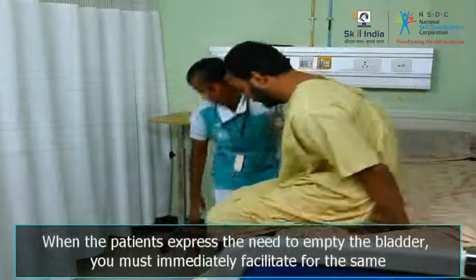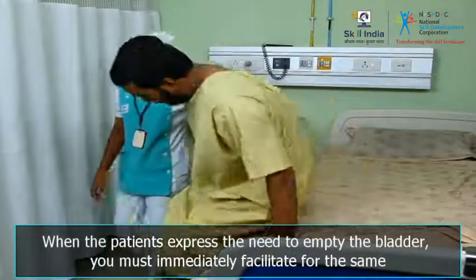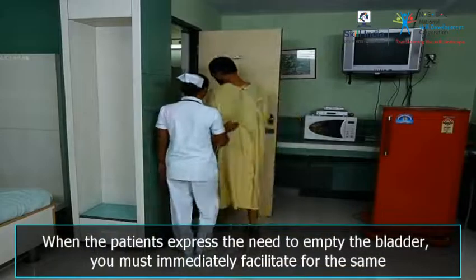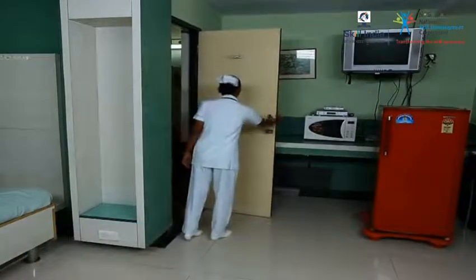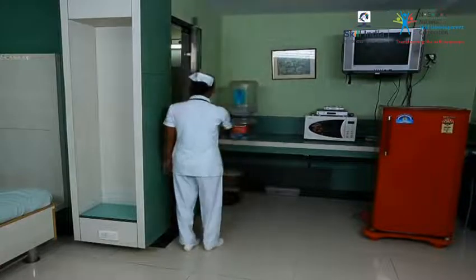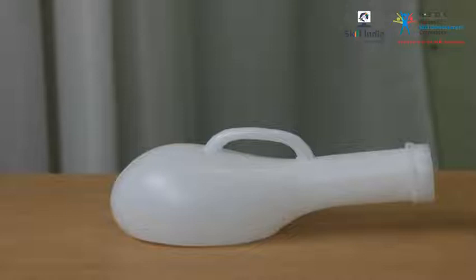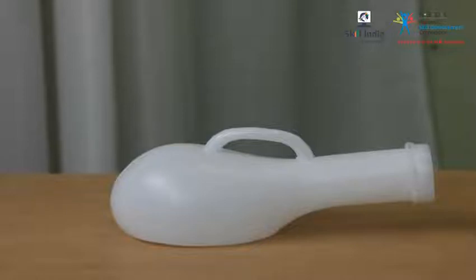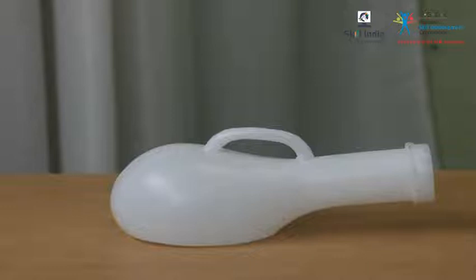When patients express the need to empty the bladder, you must immediately facilitate the same. You must help the patient to the toilet if the patient can walk. If the patient cannot walk, then you must arrange for the appropriate equipment for the passage of urine by the bed.